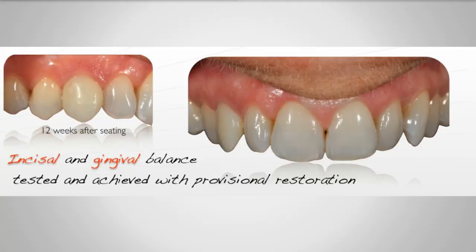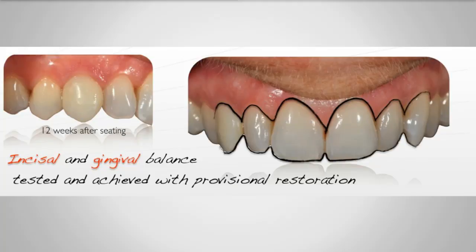This is a good communication tool because now the patient can see exactly where we're going. And I'm trying to create both incisal and gingival balance in the aesthetic zone. You can see we've got fairly coincident gingival levels and good incisal form too. And Angela's happy with that.